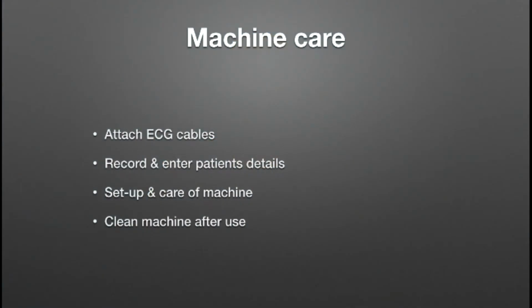When you're doing your studies, it's important to attach the ECG cables. Even in these emergency scenarios, it can be important to come back to try and figure out at what stage in the cardiac cycle you're in. And that's why it's important to have your ECG at the bottom of your image so that you can help determine that. It's important to record and enter your patient details, because you're going to want to come back and analyze these data, and in particular if you're going to want someone to review these at a later date, even if it's that day or in months to come, it's important to have the data available and know how to find it.